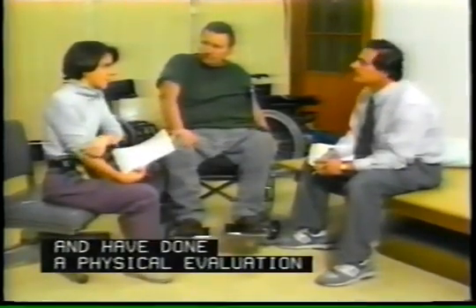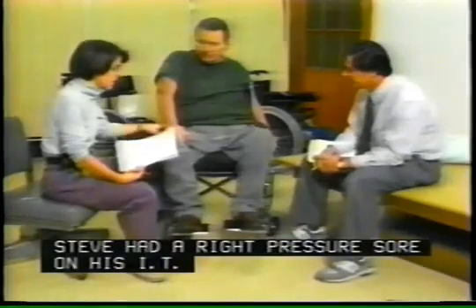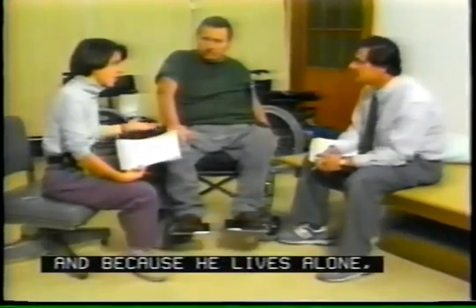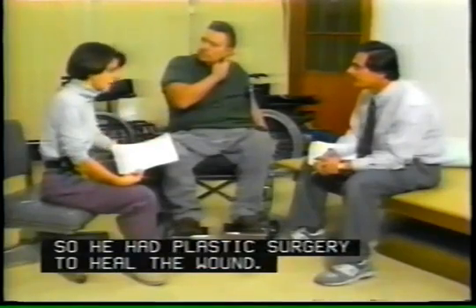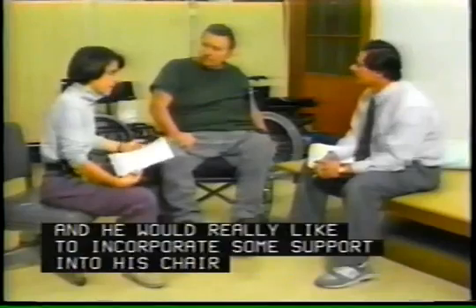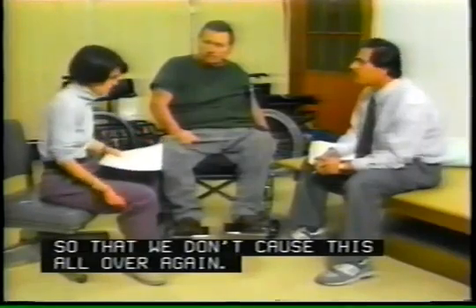I've had Steve down on the mat and have done a physical evaluation as well as some of the anatomical measurements. Okay. And the critical elements are, Steve came, he had a right pressure sore on his IT. And because he lives alone, he wasn't able to be off of it completely, and so it didn't heal. So he had plastic surgery to heal the wound. He's healed. He's back up. And he would really like to incorporate some support into his chair so that we don't cause this all over again.